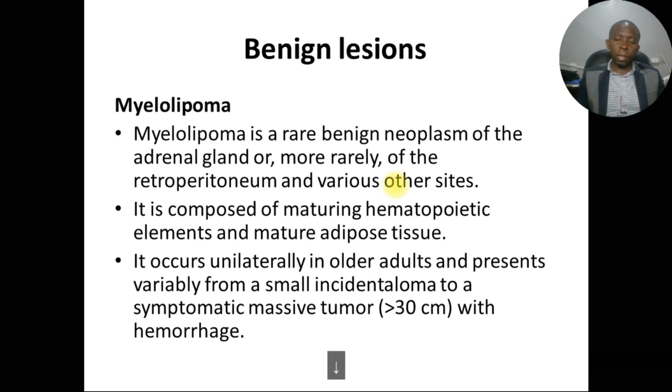This is very important, but we shall look at how to differentiate adenomas from carcinomas in subsequent tutorials, not in the next two slides, so keep watching and following my YouTube channel, because other tutorials are going to be coming up where we shall look at how to distinguish between these two. So let's begin by looking at the lesions of the adrenal gland.